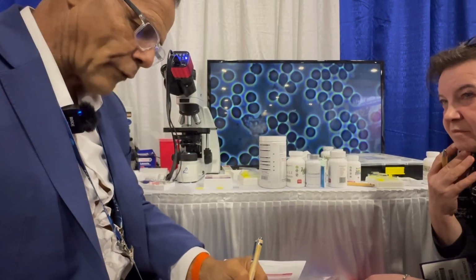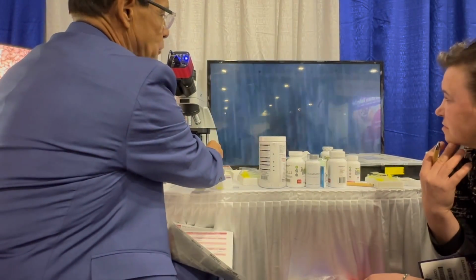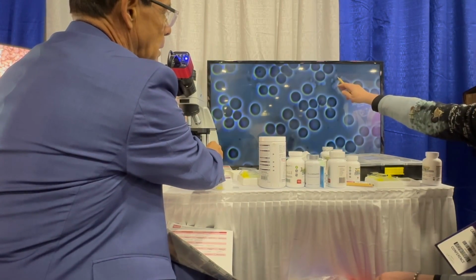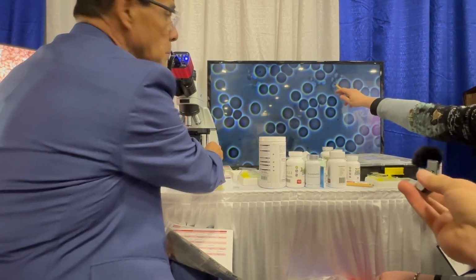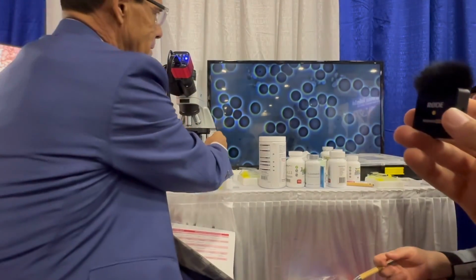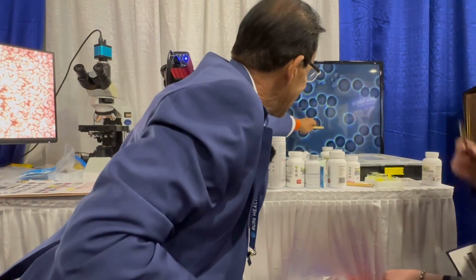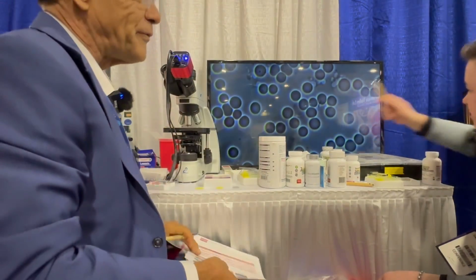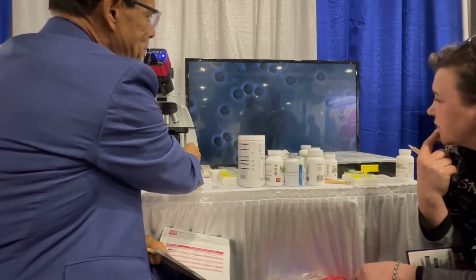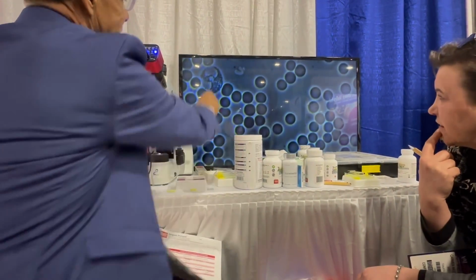Okay, and then the morphology. Did we say we saw some oval-shaped cells or not really? What is this white thing? That's the yeast, Candida. No, those are lipids. Lipids are really tiny, like this one. Those are free fatty acids and triglycerides. Now, lipids include cholesterol, but cholesterol is dissolved in blood. You won't see it.